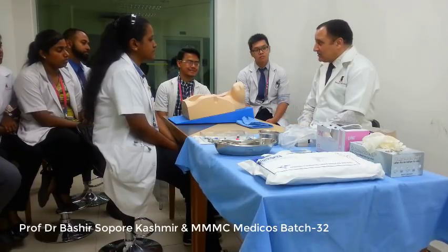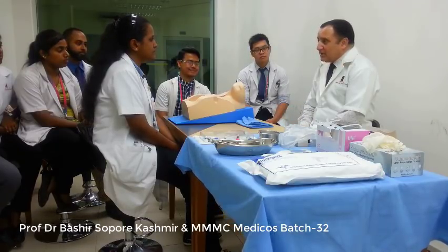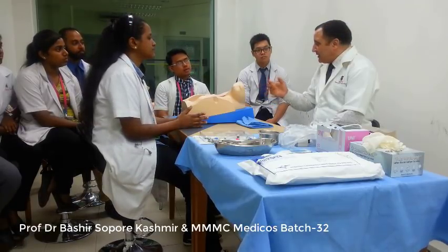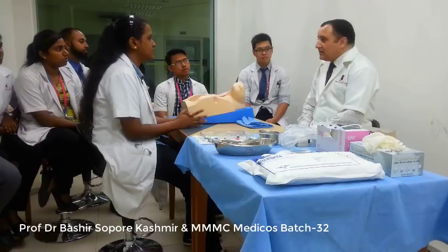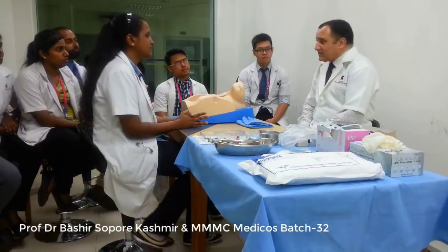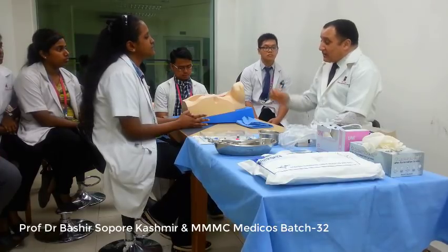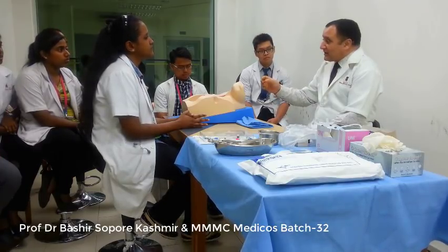Any of these nerves can get affected, and you may also injure the sympathetic ganglia resulting in Horner syndrome. The other complications are air embolism or catheter or wire shearing.